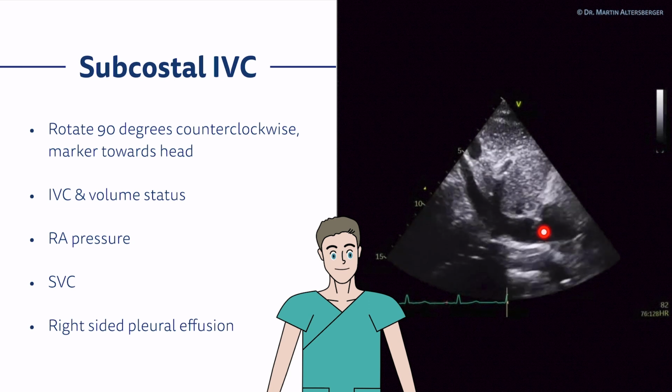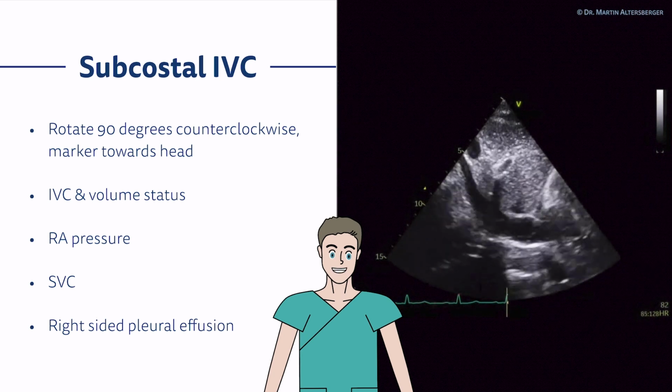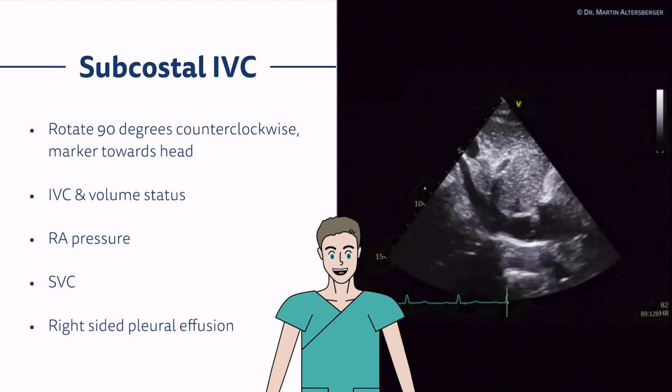Also, the SVC can be visualized. The SVC is a continuation of the IVC. And of course, you can take a look if you see a right-sided pleural effusion, which already gives you a hint towards what you will scan when you're performing lung ultrasound.